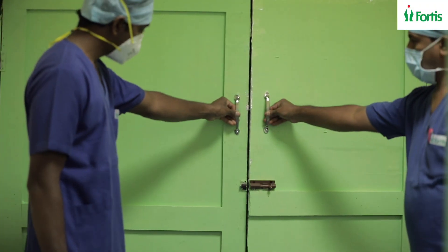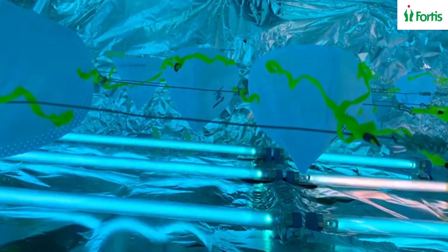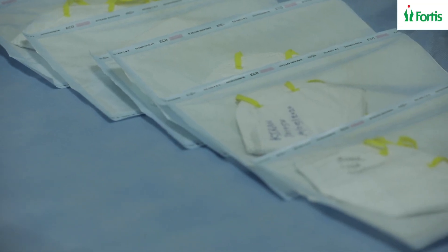Once the masks have been loaded into the closet, the door is closed and we exit the room. The controls for the closet are on the outer side of the room. The cycle is started — a total cycle of 8 minutes is required for decontamination. At the end of the cycle, the room can be entered, the closet door opened, and the decontaminated masks redistributed to the original owners.